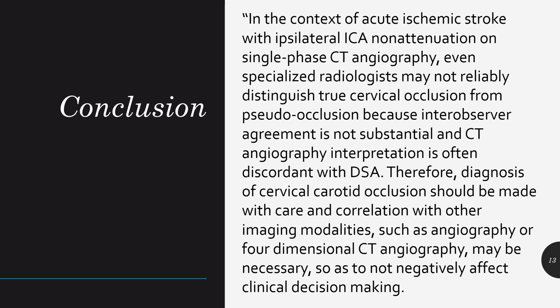So just to wrap this up, concluding as they concluded, this is a quote from their article. In the context of acute ischemic stroke with ipsilateral ICA non-attenuation on single-phase CT angiography, even specialized radiologists may not reliably distinguish true cervical occlusion from pseudo-occlusion because inter-observer agreement is not substantial, and CT angiography interpretation is often discordant with DSA.